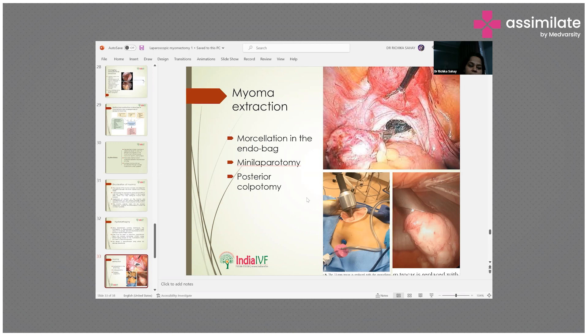In some cases a posterior colpotomy can be performed, particularly for patients who are cosmetically concerned and do not want any visible abdominal incision. The morcellated specimen in the endobag can be removed transvaginally through the posterior colpotomy.